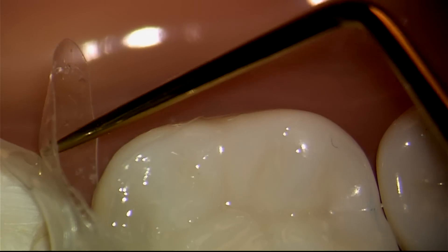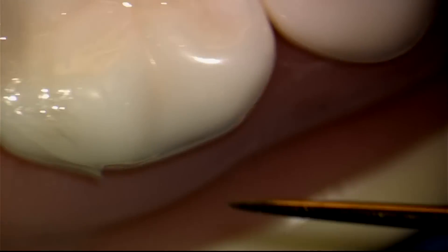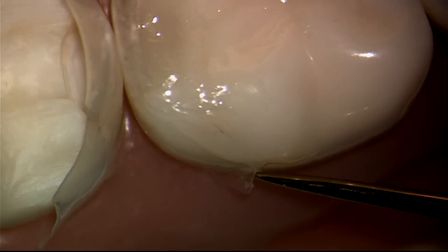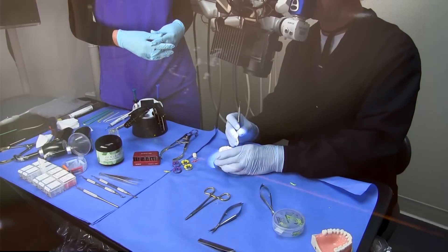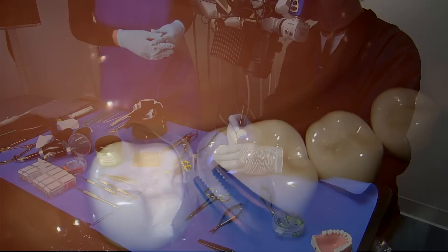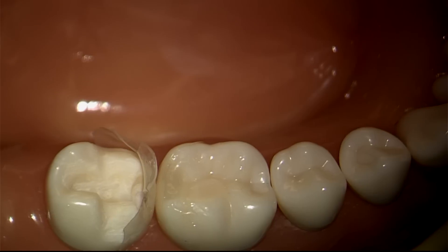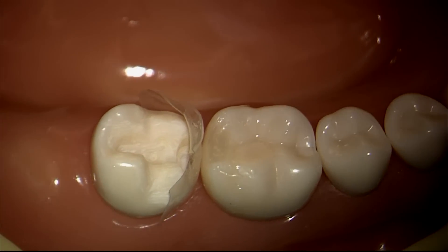Something to keep in mind is the Bioclear matrix was built with a quick release. You see the matrix is pulled away just a little bit — it makes it very easy to get purchase on the matrix and tease it away from the tooth. You're also going to notice that compared to metal matrices, the Bioclear matrix, because it's so much smoother, releases more easily from the tooth and the composite than does a metal matrix.